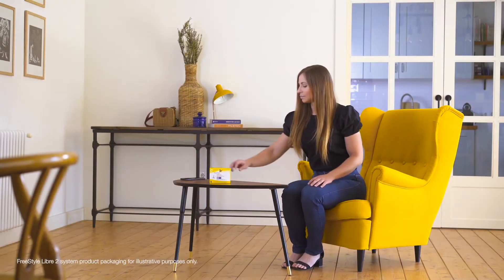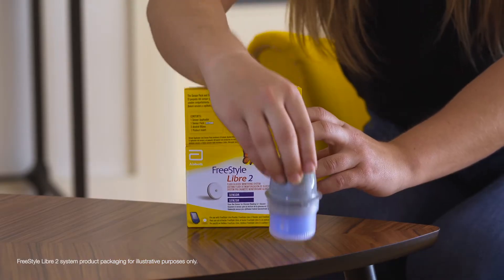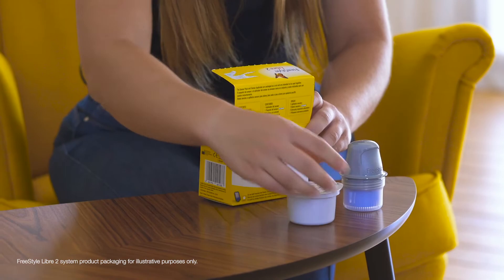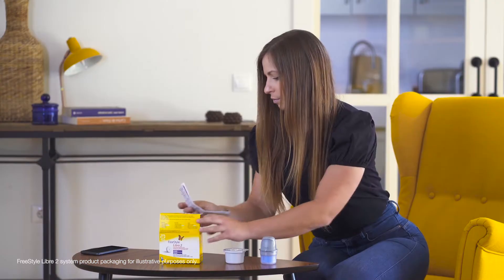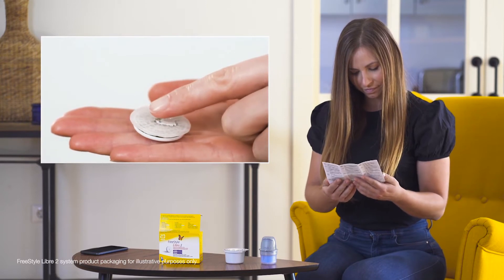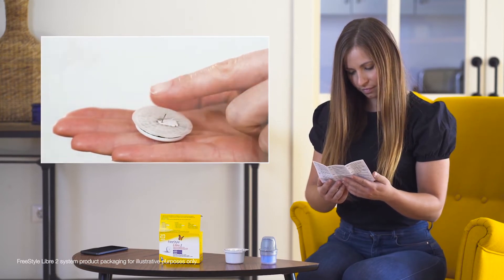This tutorial will show you how to apply the Freestyle Libre or Freestyle Libre 2 sensor. The sensor kit contains three items: a sensor pack, an applicator, and instructions. The sensor is the size of a two euro coin and weighs five grams. It has a small filament that is inserted just under the skin into the interstitial fluid.